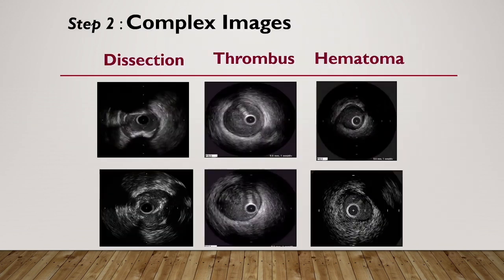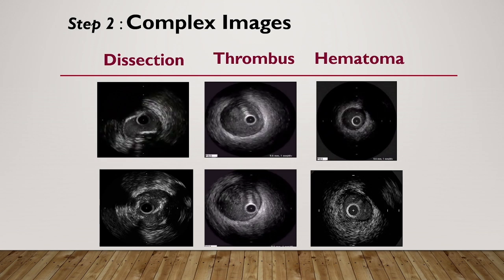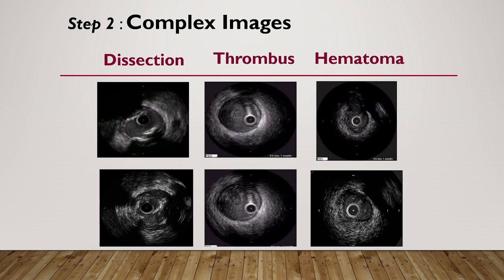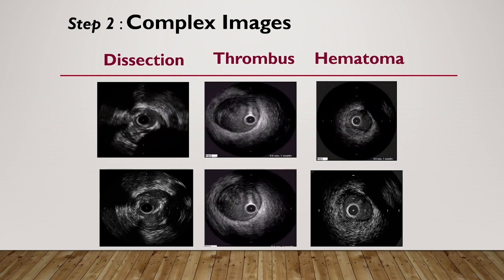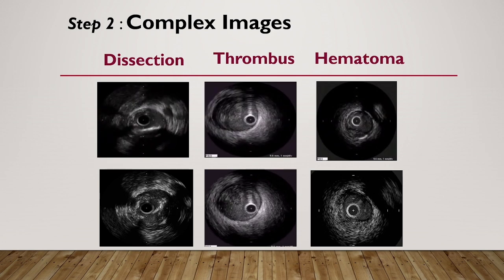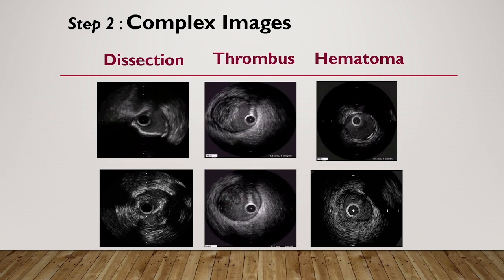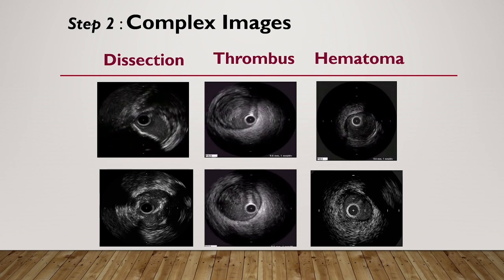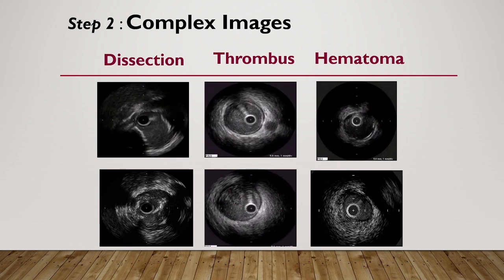And we have different calcium scoring systems. I'll not go into detail. We have nodular calcium. We have different types of nodule. In IVUS, you can go and see. And there are calcium scores. Based on the scoring system, you must identify a calcium score of more than 2 in an IVUS calculation, so that you use appropriate tools like IVL or rota or orbital to modify your calcium before doing angioplasty.